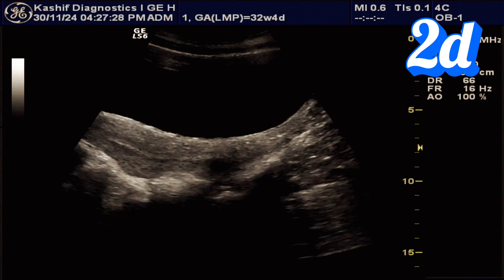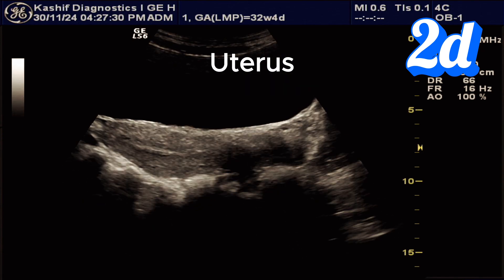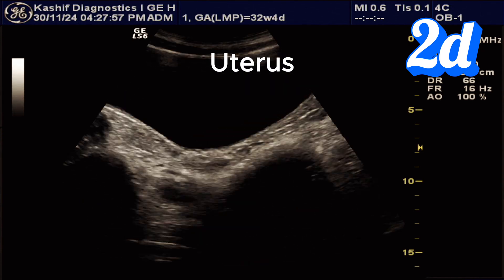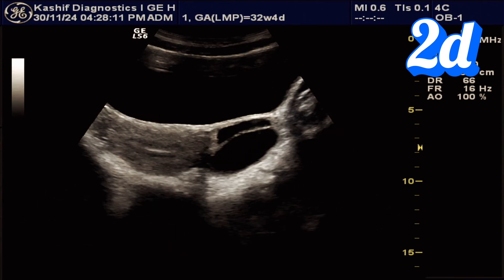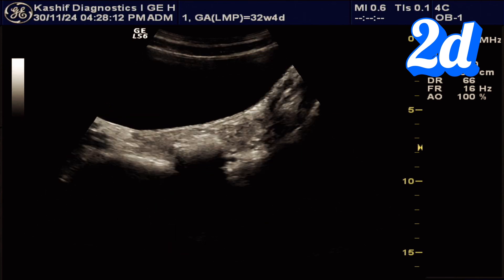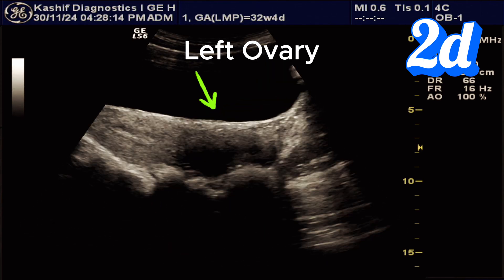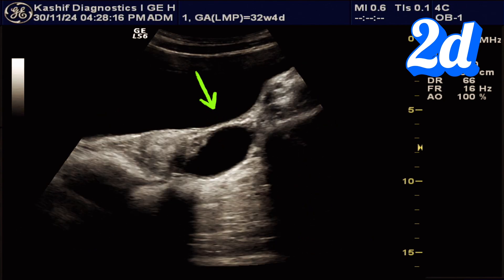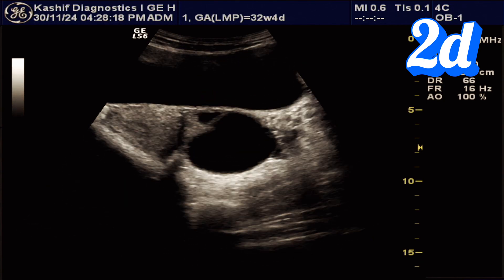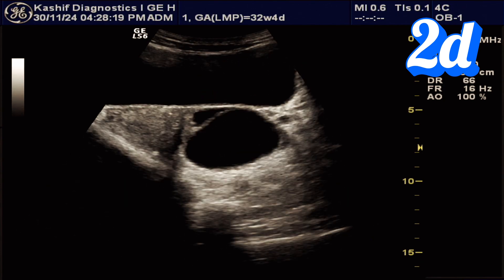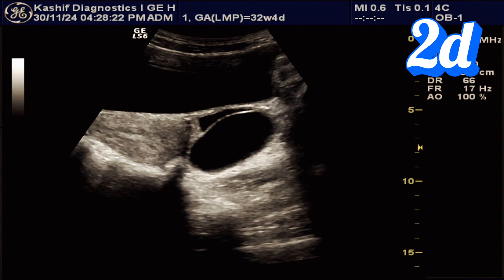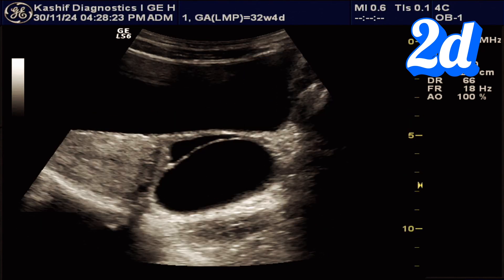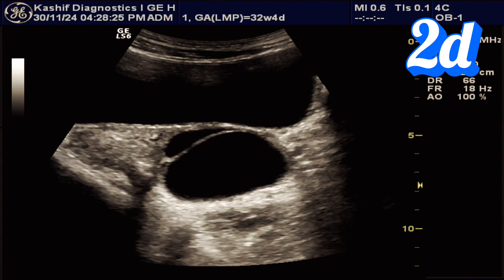Let's start with a standard 2D ultrasound scan. The uterus and right ovary appear normal. However, in the left ovary we find a well-defined cyst measuring 41 x 36 mm. The cyst has a smooth thin wall filled with clear fluid. There are no internal septa, no debris, and no solid component or calcifications.